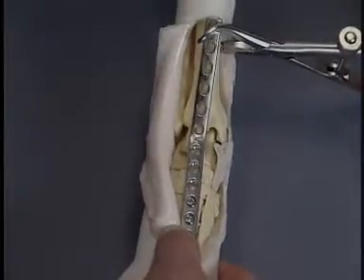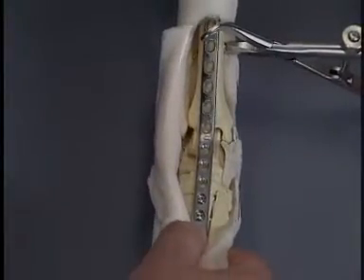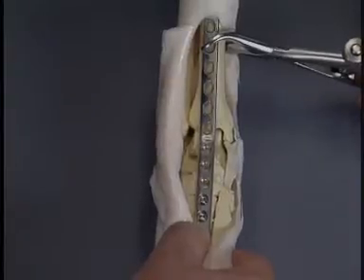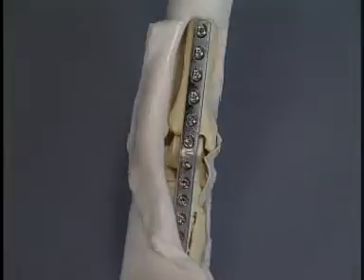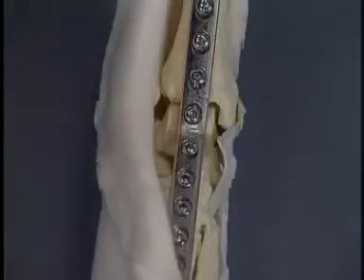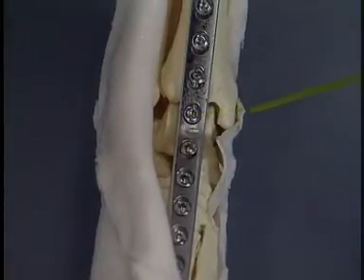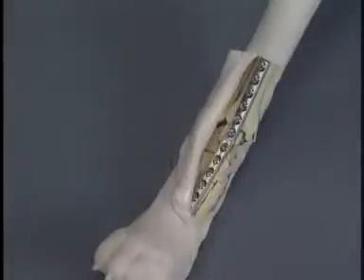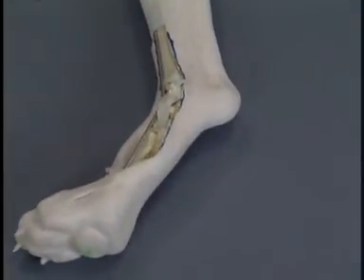The plate and joint alignment are checked, and the plate is secured to the tibia. The remaining plate holes are filled. At least 2 plate screws should penetrate the calcaneus to secure the joint. The axial alignment of the limb and the angle of the arthrodesis are critically observed.